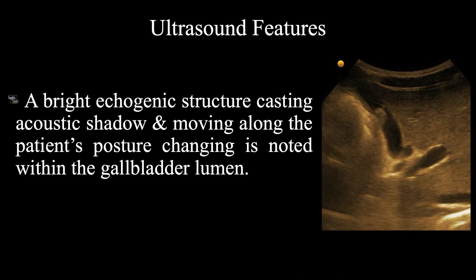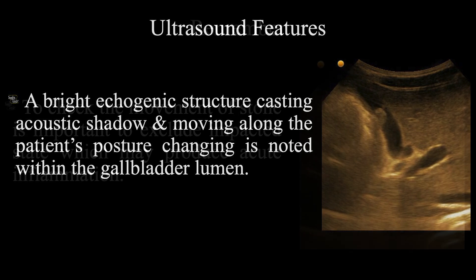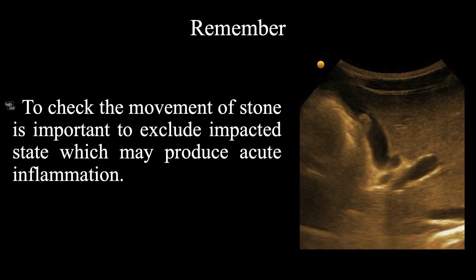In summary, a bright echogenic structure casting acoustic shadow and moving along with the patient's posture change is noted within the gallbladder lumen. There is a tiny echogenic foci at the wall of the gallbladder casting comet tail artifacts, suggesting adenomyomatosis. Another take-home message: to check the movement of the stone is important to exclude impacted state, which may produce acute inflammation.